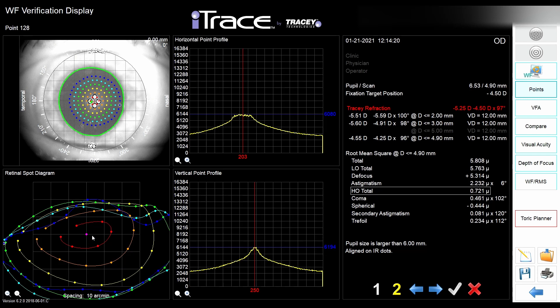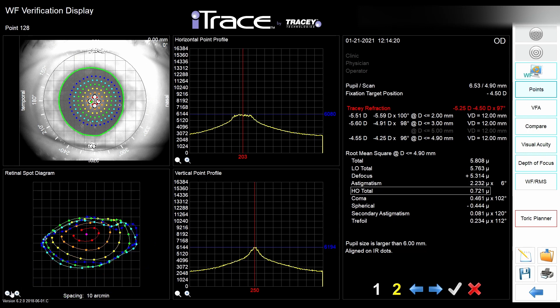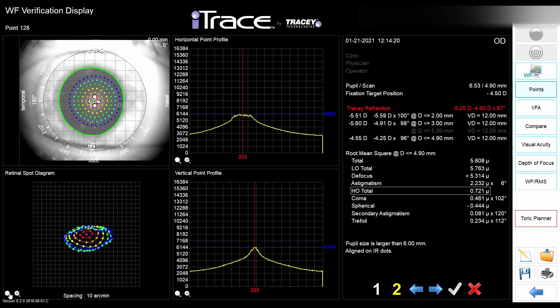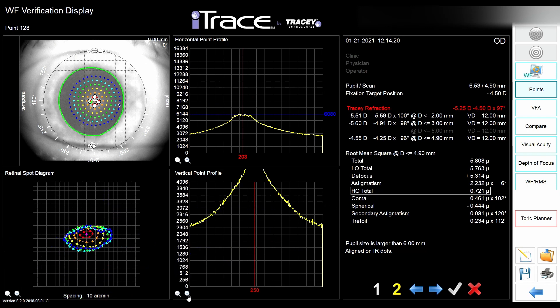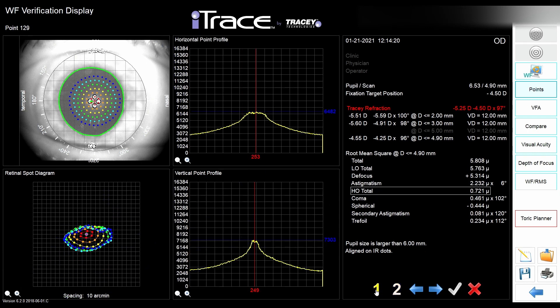This technology is most useful for keratoconic eyes and patients with higher-order aberrations. You can see whether those points align in one single point — the optimal situation in an eye where all points fall on one spot on the retina. Here that's not the case because the patient has 4.5 diopters of astigmatism. You can see this astigmatism — the patient sees the world like an American football.